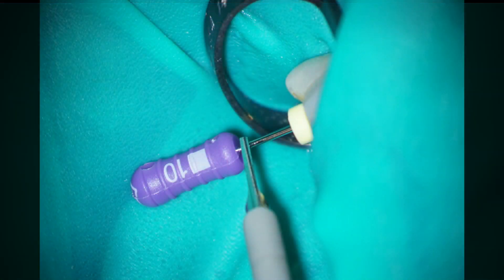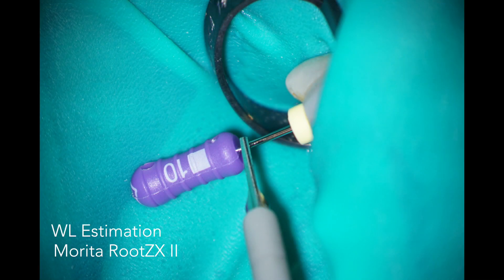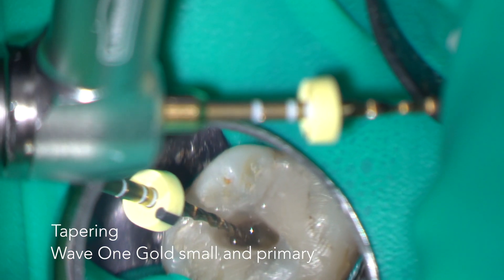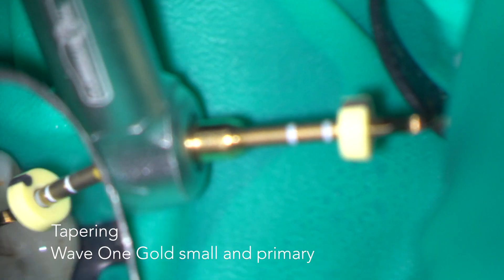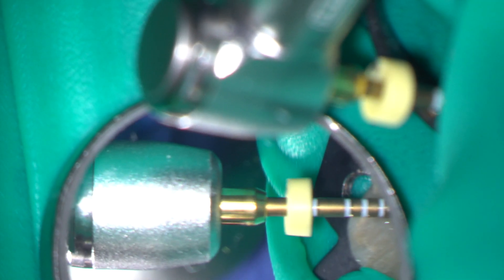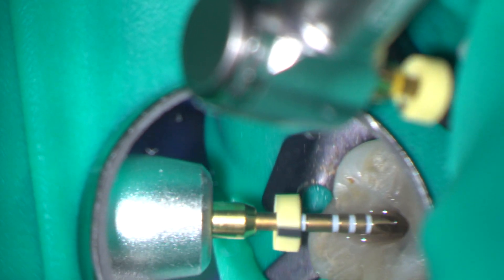An apex locator was used to estimate the working lengths, reading to the zero reading and using a reproducible reference point. Now it's a simple case of tapering those root canals. In this case, I used a Wave 1 Gold Small and Primary Instrument, interspersed with patency filing and irrigation with 3% sodium hypochlorite.